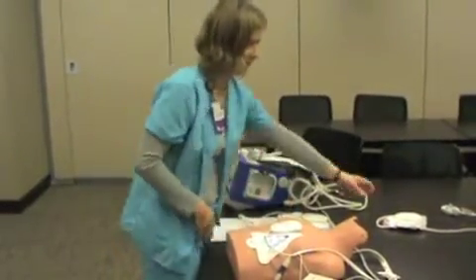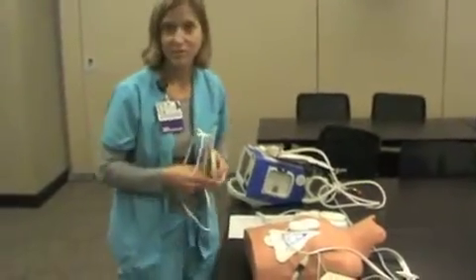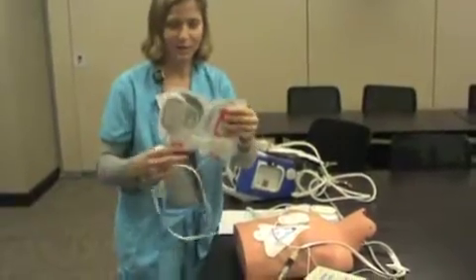Also, I'll tell you that we have pediatric pads. Let us all pause and pray to God that we never have to go to child. But if we do, we have pads.